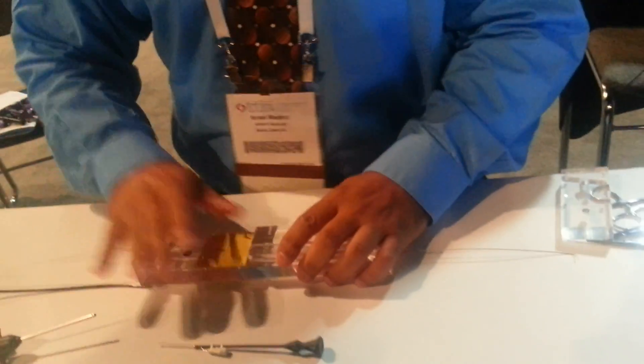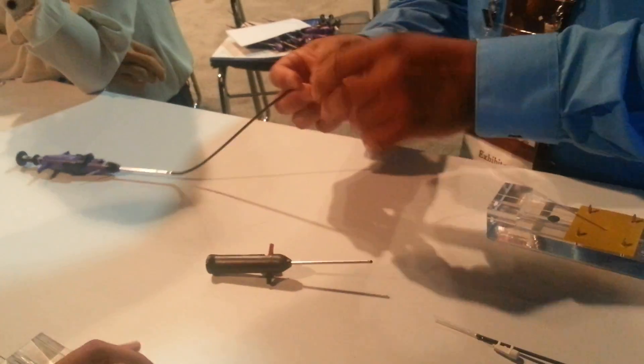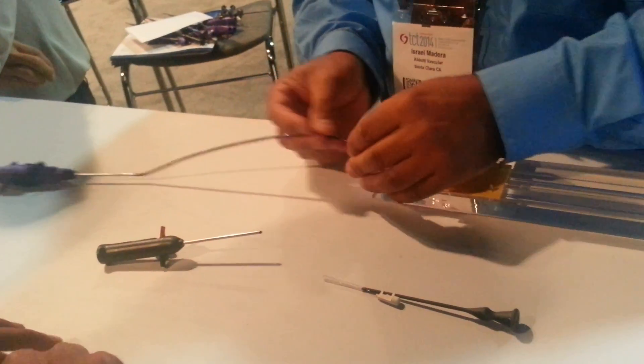Alright, here we go. We're going to back load. Take the device. Your wire is right here. I can't see right now. Make sure your logo stays at 12 o'clock.